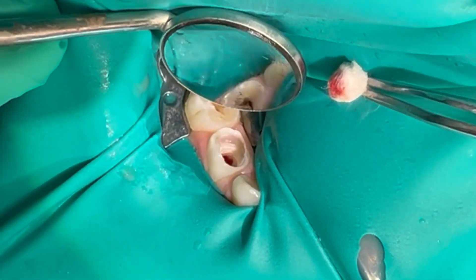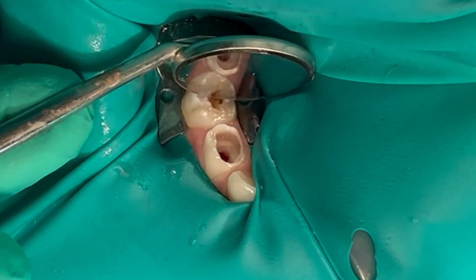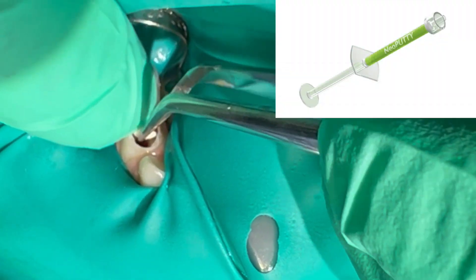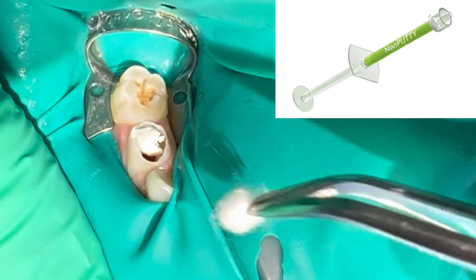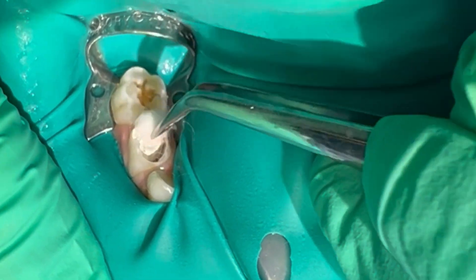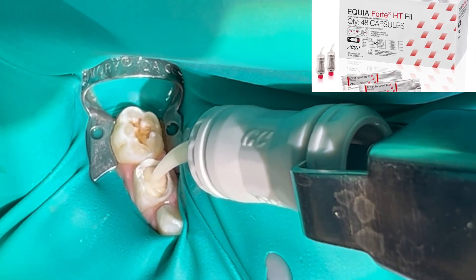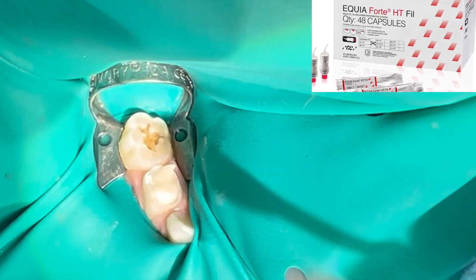Please feel free to watch my previous vital pulp therapy videos, but the pulp should be non-bleeding after the removal of cotton pellets. The pulp therapy is then applied, which is Neoputti by Nusmile, and then GC Equiforte is placed as an obtundant and is condensed into the chamber.